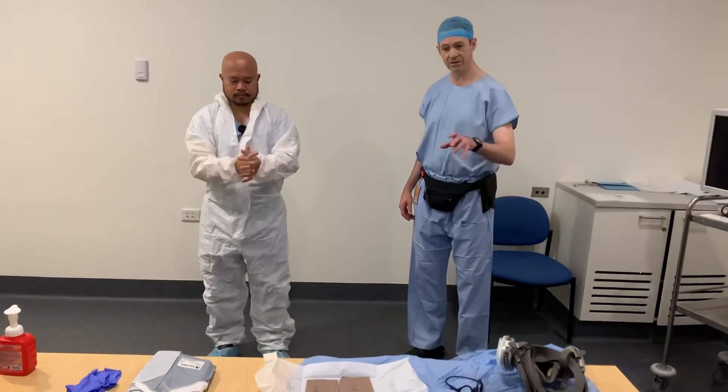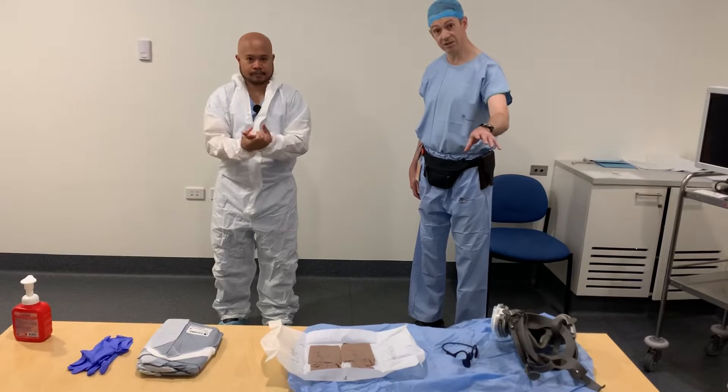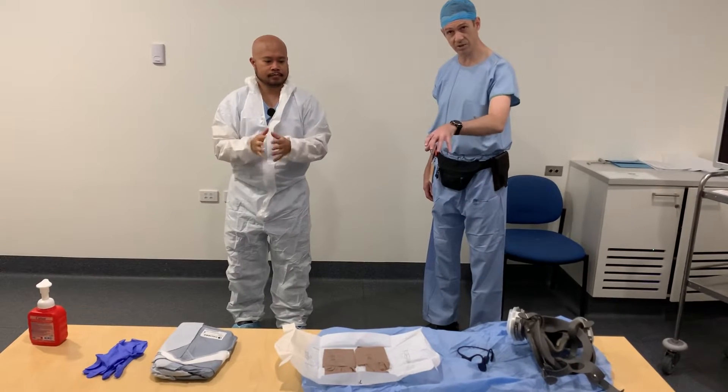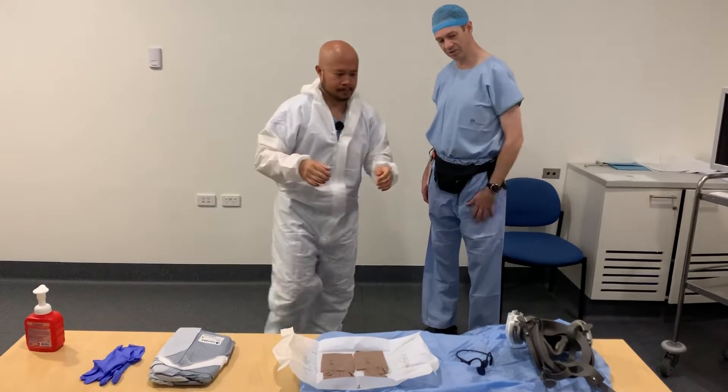I've laid out the equipment that we're going to wear from left to right. This is in the anaesthetic bay, in the anaesthetic department, before we go to the second stage donning procedure. We're going to start with the 3M 6800 series mask.